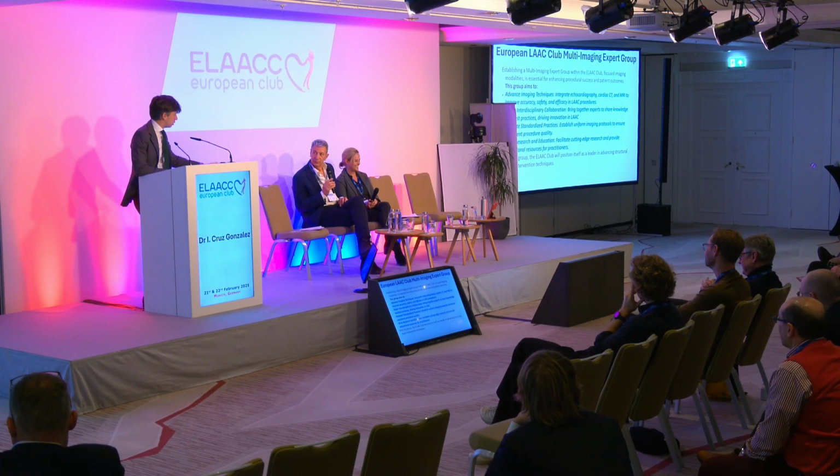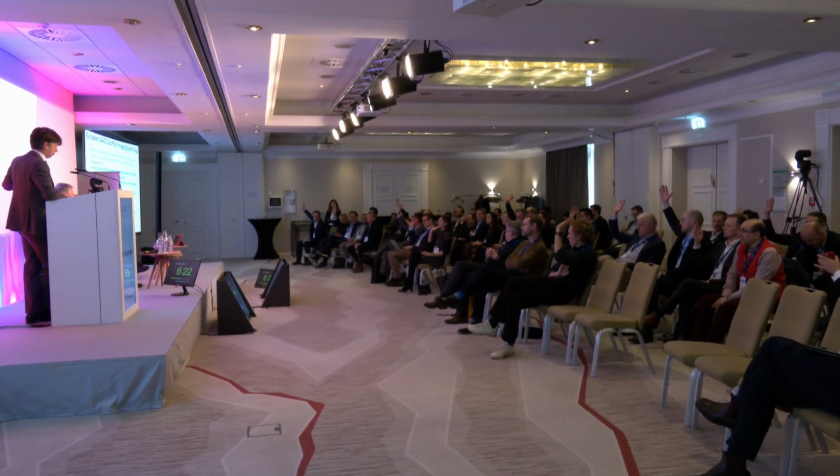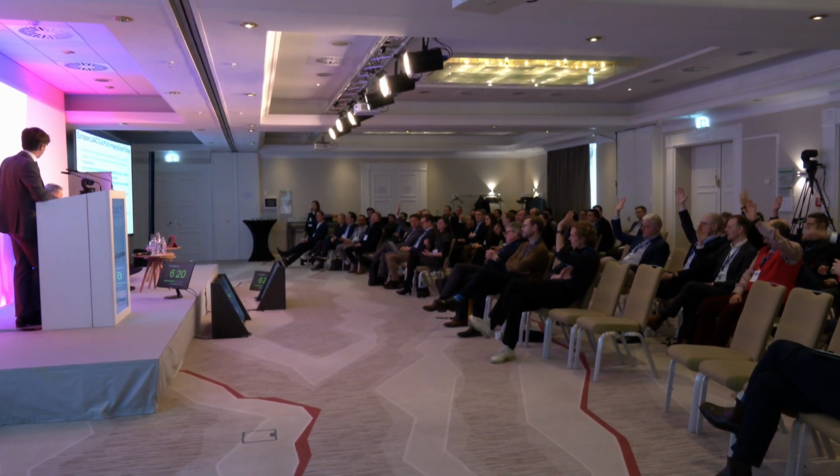Okay, Ignacio. Just one question for you. Do you think that we need to validate the ELAAC criteria also with TEE, so an independent cohort of patients, maybe based on the ELAAC registry, or is just the data that we are going to get with the CT analysis enough? Ignacio, you can let them vote. Who is in favor of validating it for TE? There's consensus. Easy.